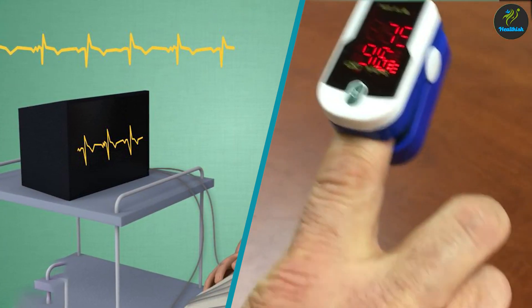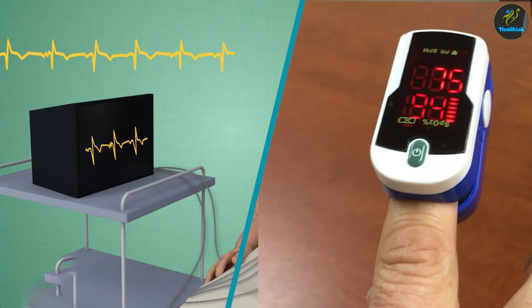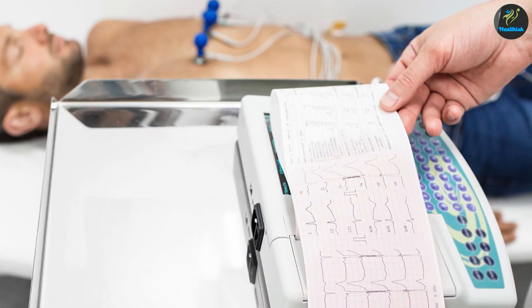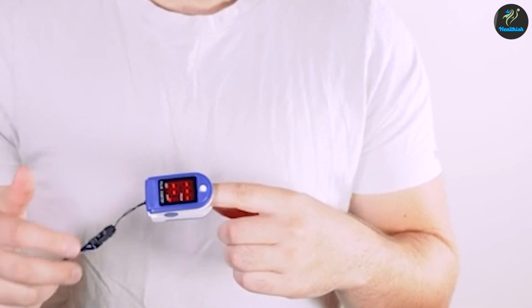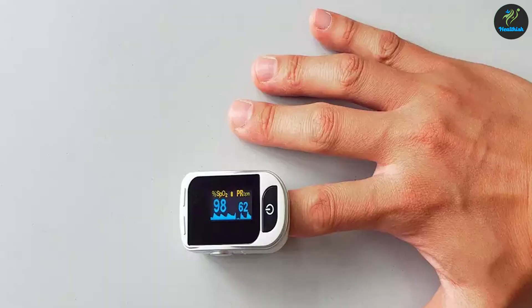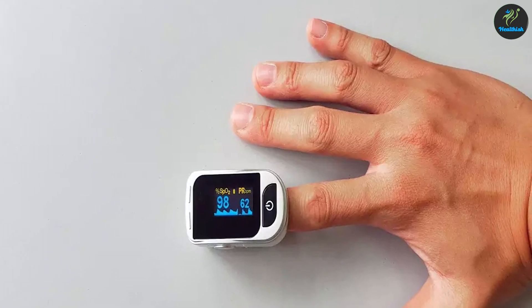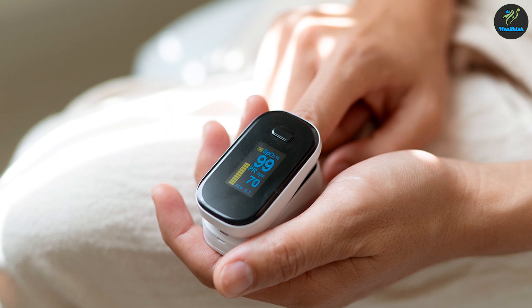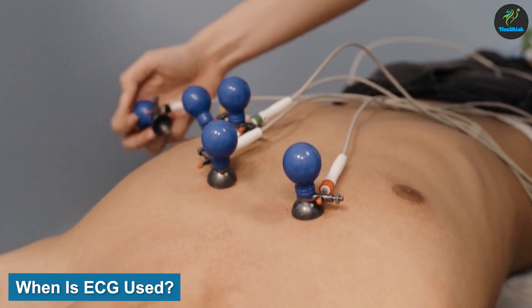Another difference between ECG and pulse oximeter is the accuracy of the readings. ECG provides a more accurate measurement of the heart's electrical activity, while pulse oximeter provides an accurate measurement of oxygen saturation and heart rate. However, pulse oximeter may not be as accurate in certain situations, such as when a person has poor circulation or is wearing nail polish.